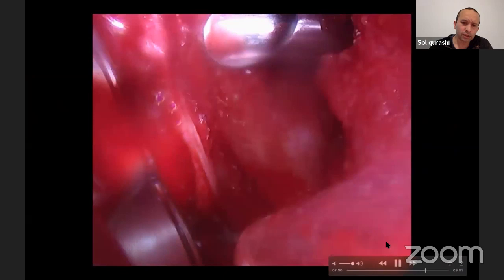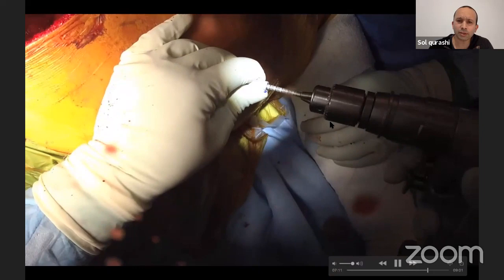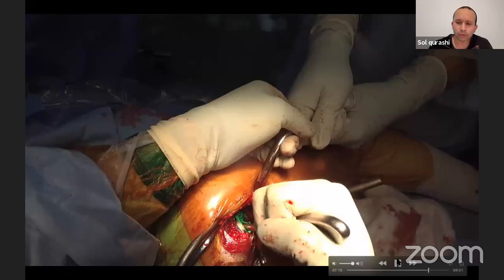This is how we put screws in, the drill guide into the hole. Drill's got measurements. One anterosuperior 15 millimeter screw. One directly superiorly or slightly posterior superiorly 20 millimeter screw. Once the screws are in, I put the trial liners. In this situation, I put in a definitive liner.